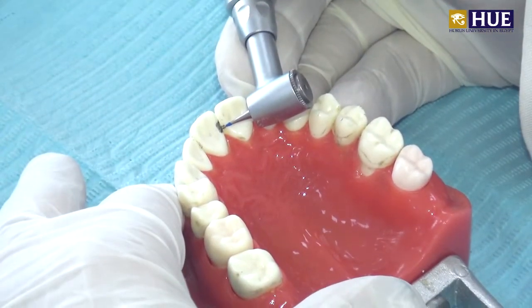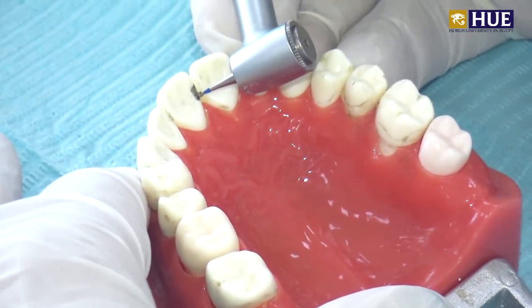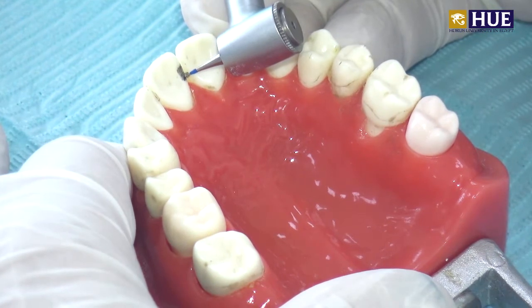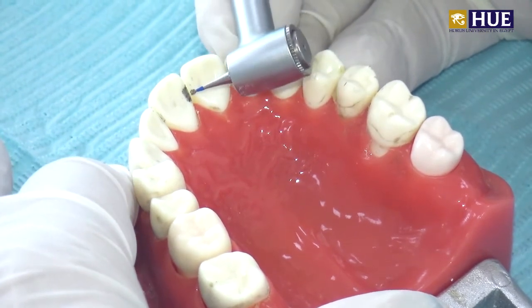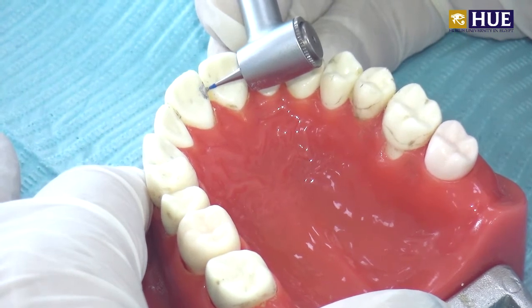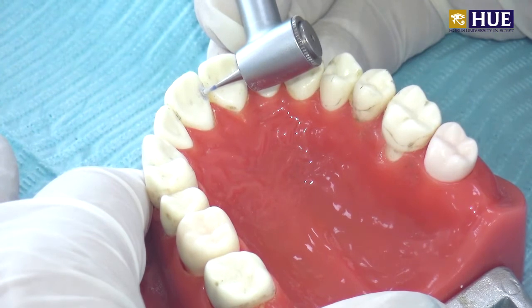The outline form I mentioned before was marked with pencil like this, and the design is called conventional class 3 or GV Black conventional class 3, which includes enamel margins, or all cavity margins confined within the coronal portion. Begin access at slow speed in the center of this marked area, as close as possible to the adjacent tooth.